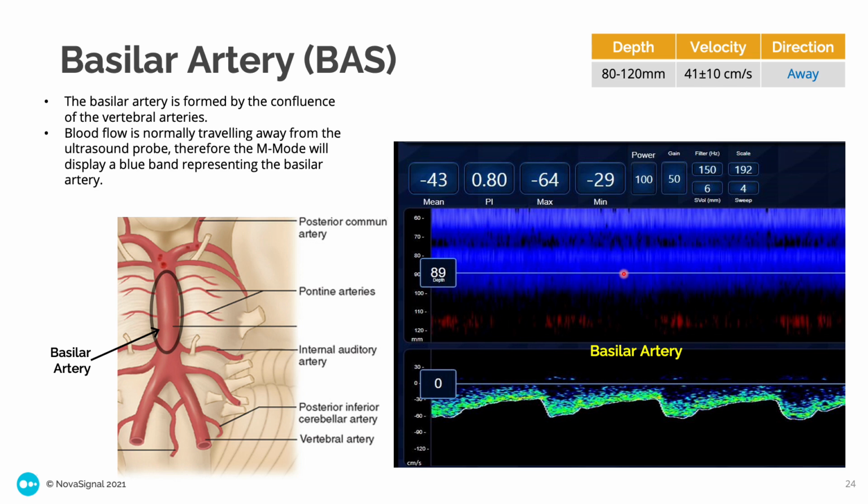Most of us, as we should be, are really focused on sound. In my experience, as the sound gets weaker or as the sound completely disappears, we all tend to start to make bigger movements, almost a sense of panic that we're losing things. So using the M mode to adjust your transducer is quite helpful. For example, if I wanted to listen at 110, I would angle the transducer and not change the sample volume depth until I got blue flow at 110.